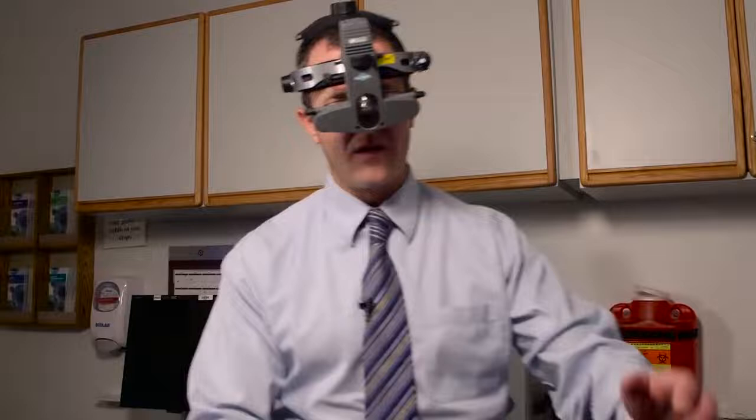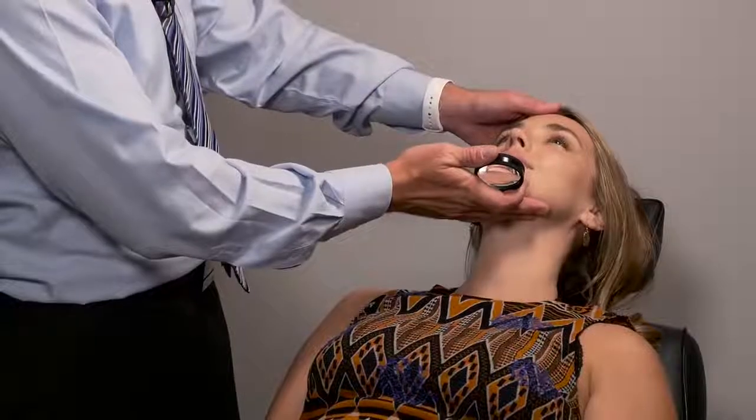Do the same thing every single time, because when you have to start drawing and writing things down, and you see multiple changes in the eyes, it can become very complicated. This way you don't have to get up and do the exam over and over again. So the patient will stay nice and relaxed, like they're at the barber shop or the beauty salon, because you're going to position their head around a little bit. I'll start with the right eye.